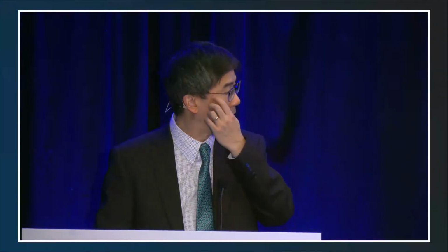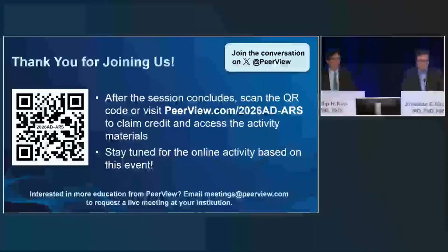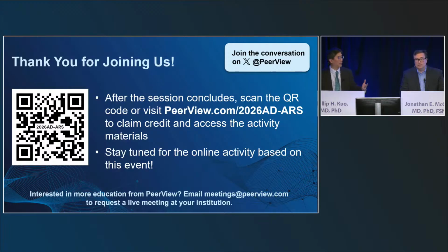Yeah. Do challenges arise when a patient has a history of previous neurological insults, including surgery and stroke? Absolutely. The main thing, if you have any, particularly old stroke, and you have atrophy or any neurologic insult, is to avoid that area when interpreting amyloid PET. Really emphasize interpreting the areas of the brain that are the most normal, have the least atrophy. And certainly quantification will not help you at all and can actually give you a very wrong answer when you have neurological abnormalities.